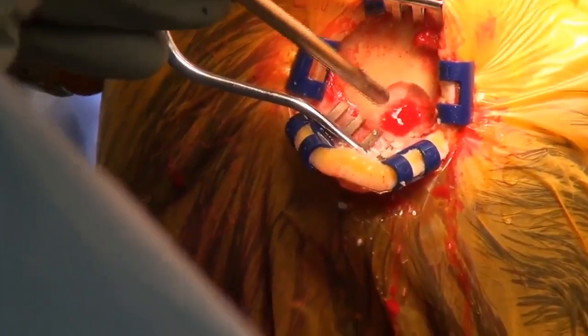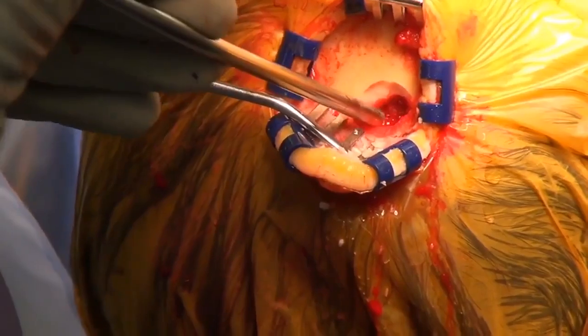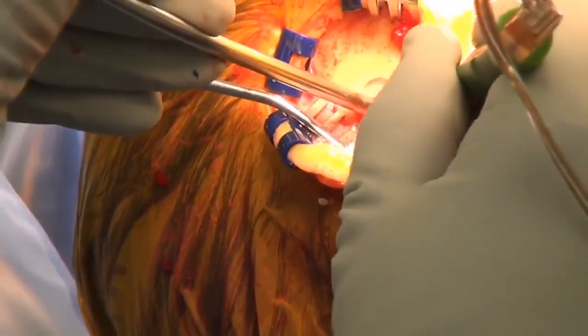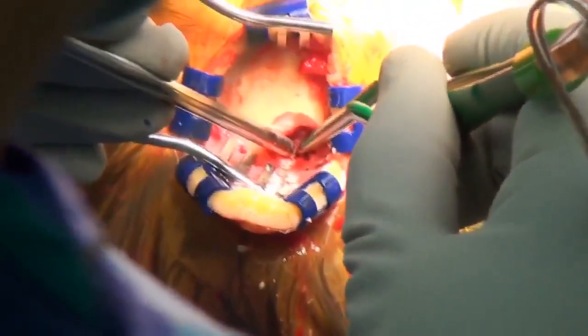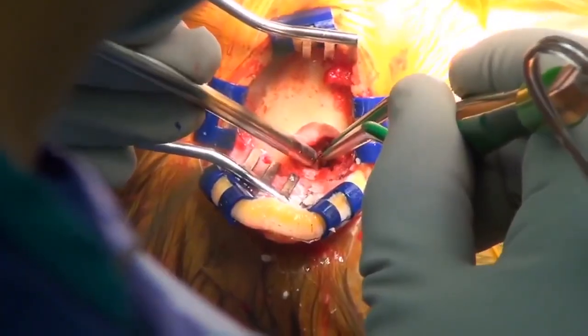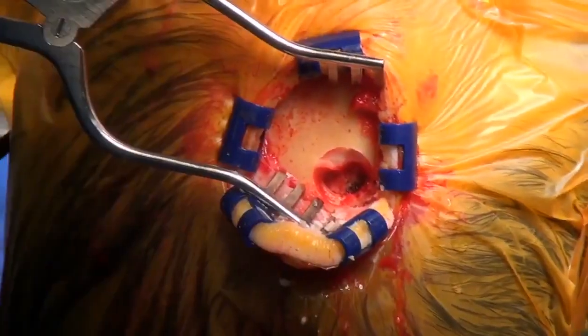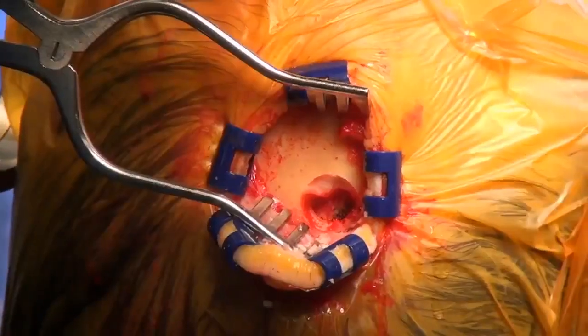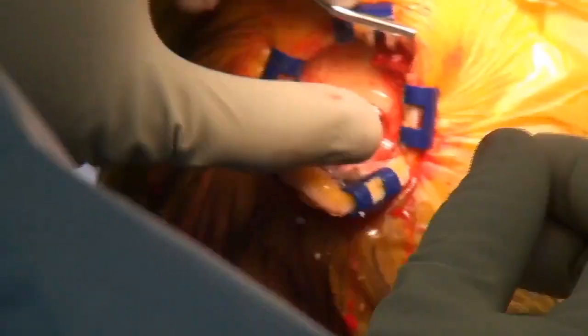Oh, okay, bipolar. Okay, that's good. All right. Yeah, let's start a stim lock. I think we're good there.